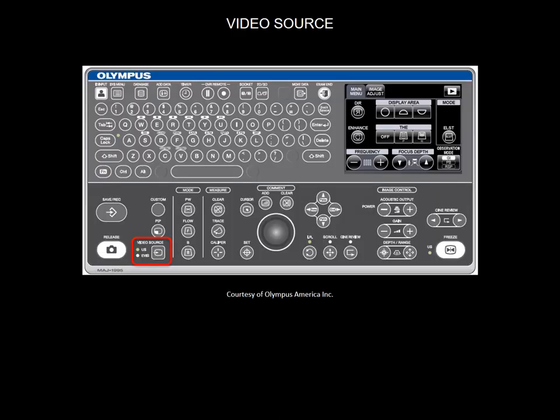On the keyboard, the video source should indicate US for ultrasound. You have the option to display the ultrasound image and the endoscopic image together on one single monitor by pressing the PIP button.